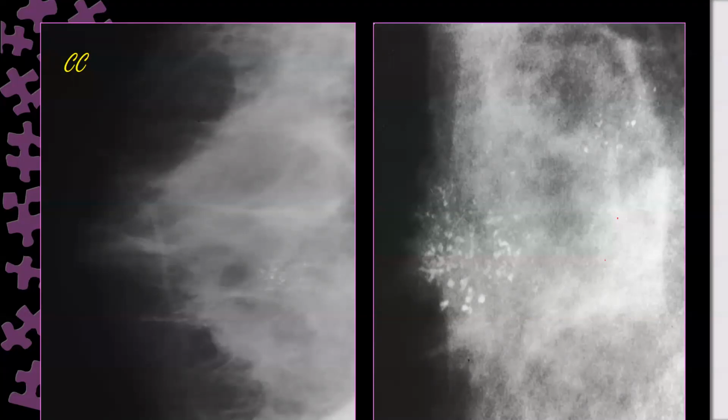In which way? How does it help us? It's showing the microcalcification in segmental distribution, and polymorphic in segmental distribution. There are two areas of microcalcification. Here I cannot say a segmental distribution.